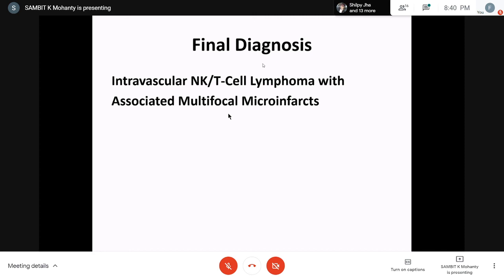But nowadays, if you have flow and everything with you, you feel more confident signing out the cases. At least we release the report with histology and immunohistochemistry, and we release another report as an addendum once we have the other findings, the molecular, available.